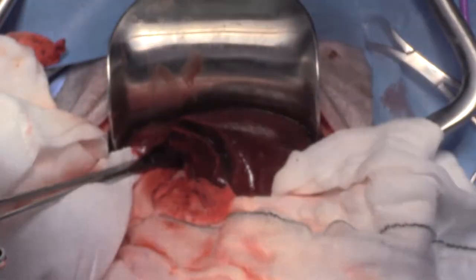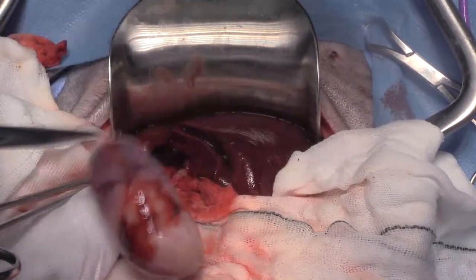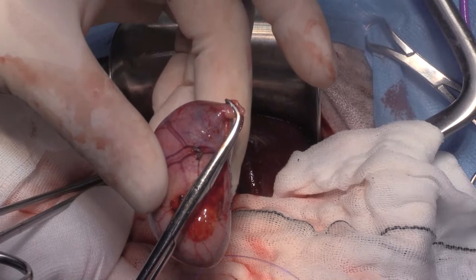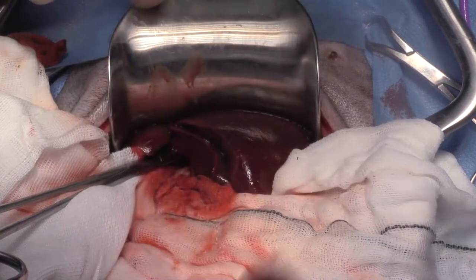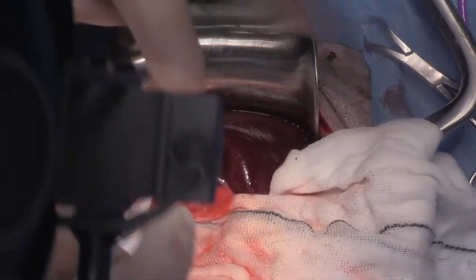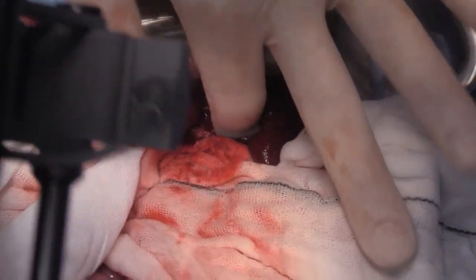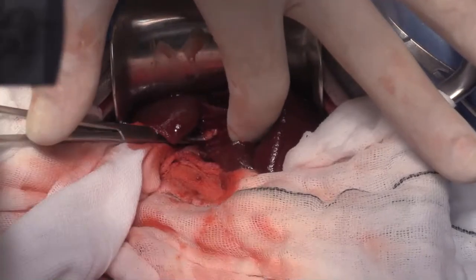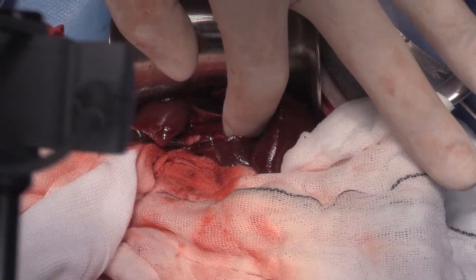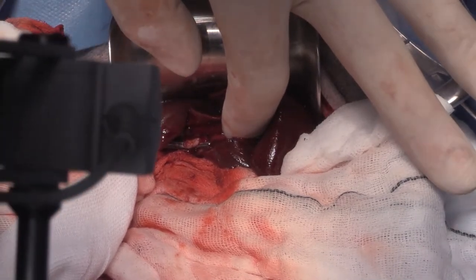Okay, so that's our gallbladder with my clamp around the cystic duct there, and I've still got a clamp inside here that we need to get a suture around, which we'll do in just a second. So, not sure how well you guys can see down in there now. Put my light on. Is that a little bit better, Jeff? Can you see that better with my loupes on that?